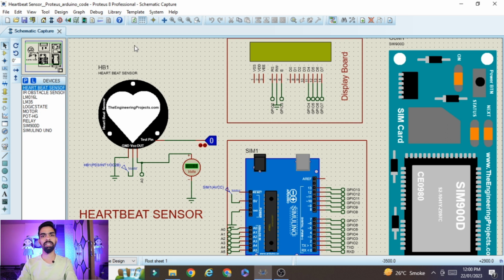Okay, before starting the next part, I would like to tell you what will be the flow of this project. So you can see on the screen we have the heartbeat sensor, then we have the GSM module, then we have the Arduino and LCD. So basically whenever the heartbeat sensor starts reading the heartbeat, whatever the heartbeat is, it will show on the LCD. Then if the heartbeat is below 30 or above 100, then automatically the GSM module will send the message to a particular user mobile number, that is an emergency condition. So this is the complete flow of this project.